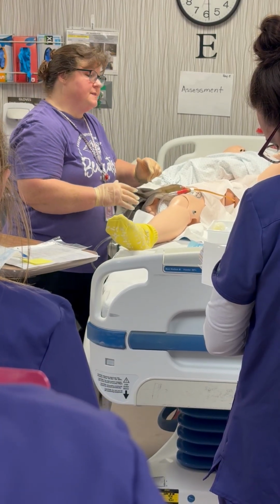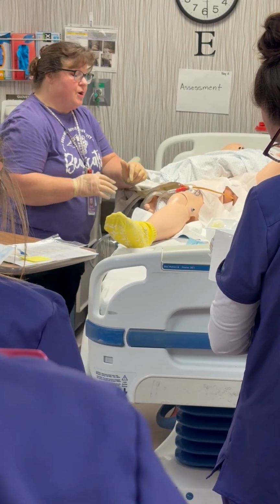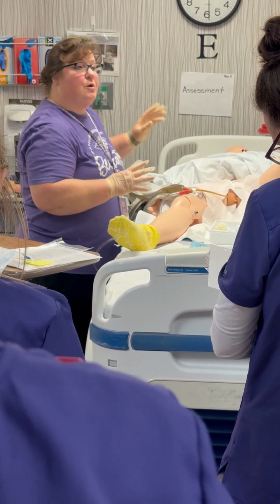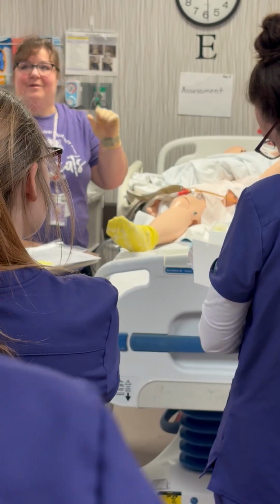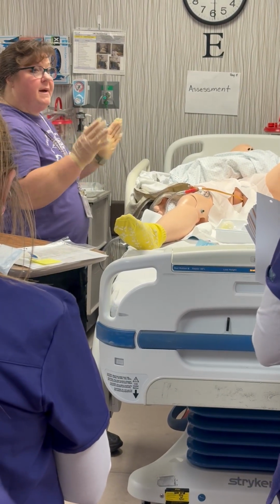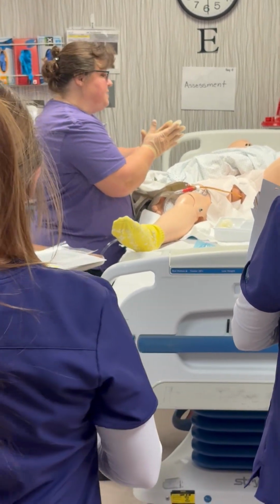Then your instructor is gonna say, okay, 3 days later, let's take it out. Okay, so you're gonna come in. Is taking out a Foley catheter a sterile procedure? No. No, it is not. So you only need clean gloves. You can leave these on while you're doing it. It will save time, okay? But know that you're gonna have to say, I would come back in, wash my hands, put my gloves on, okay, to take this out. Explain the procedure to the patient.